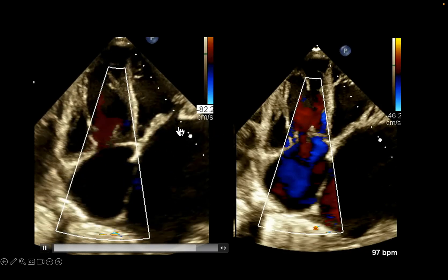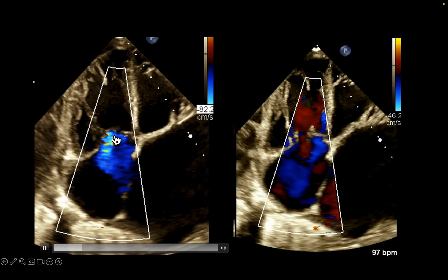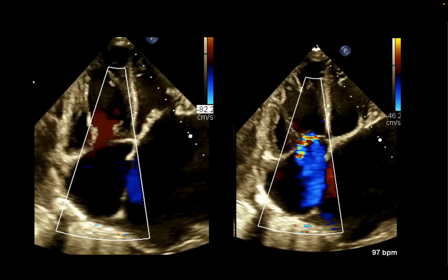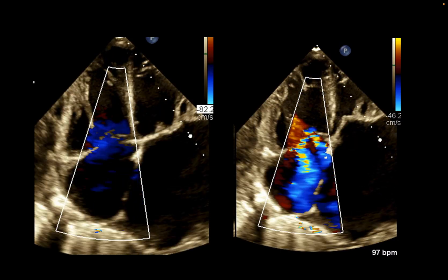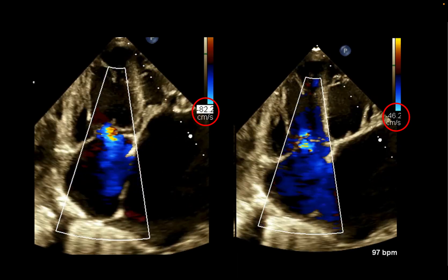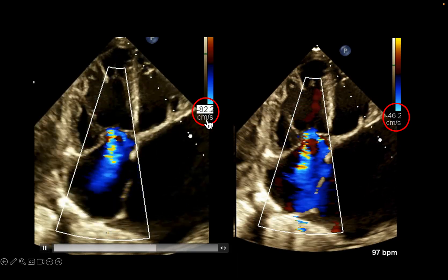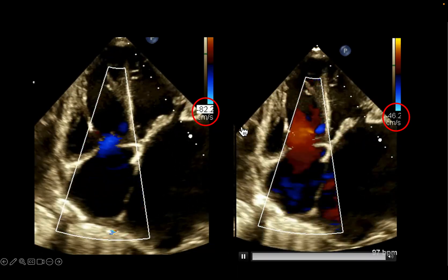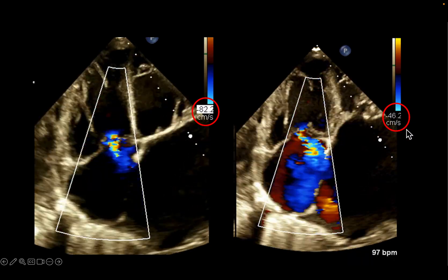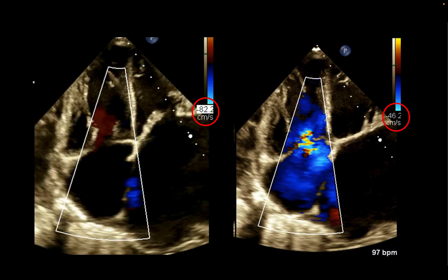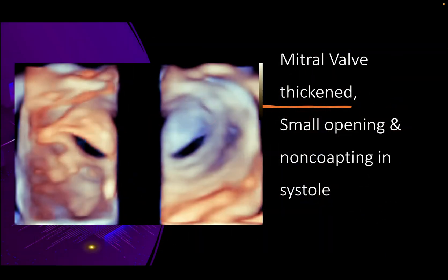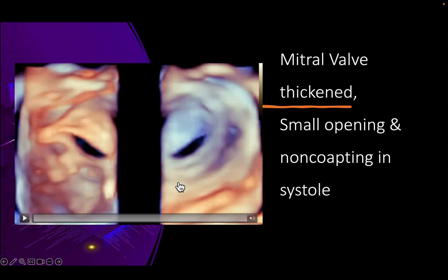In the same patient, tricuspid regurgitation appeared mild on the initial color Doppler view but was actually moderate to severe. What happened was that the initial scanning was done with a very high Nyquist limit of 82 centimeters per second. The recommendation for valve regurgitation assessment is that the Nyquist limit should be between 40 to 50 centimeters per second.